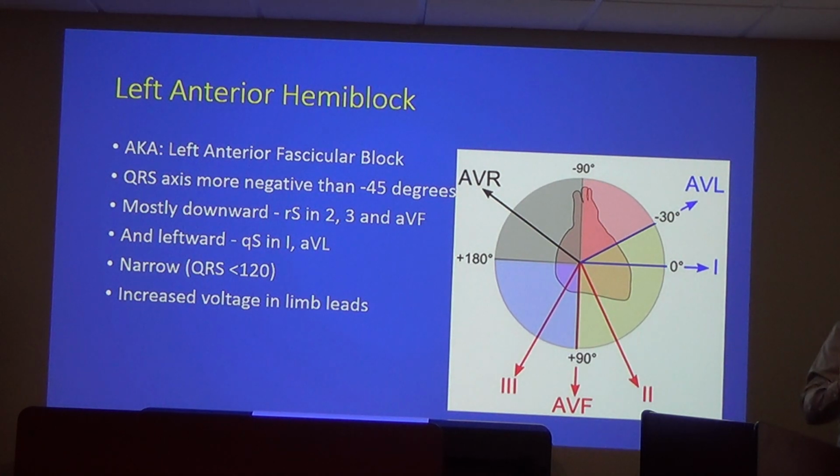So that gets complicated, and I don't want to get too far into it. What I really want to do is make sure you know that the hemiblocks are not a width, but they're an axis issue, which can be measured, and I'll show you how.